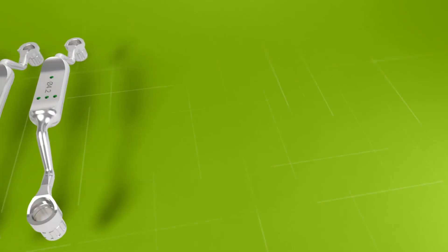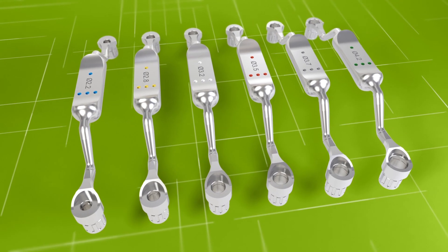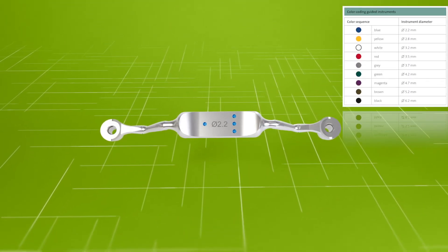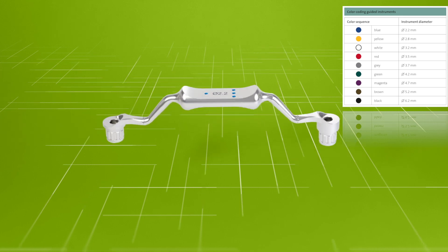The Straumann Velodrill system has special self-locking T-sleeves that are used with the self-locking drill handle. Drill handle colour coding matches with the drill colour coding system; each colour corresponds to a different diameter.